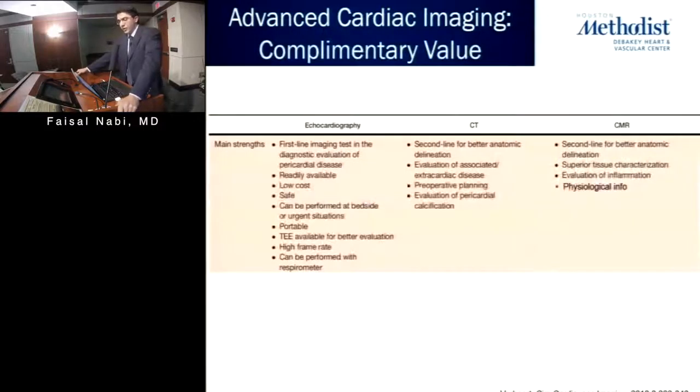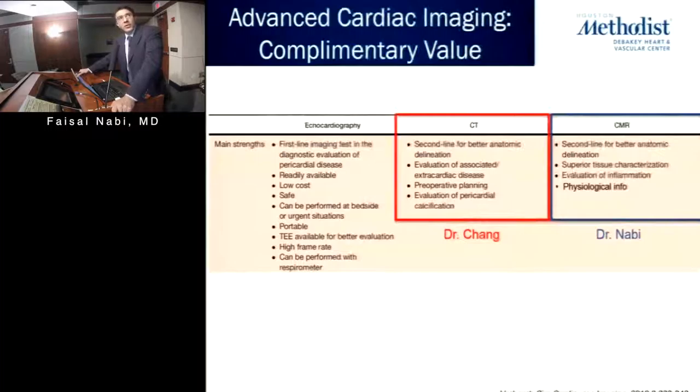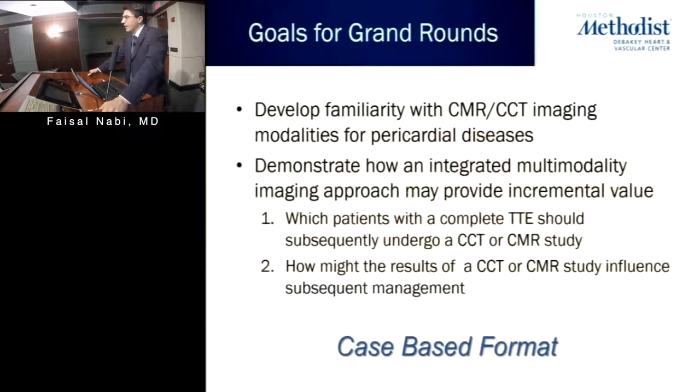So for the purposes of this talk, we will be focusing on the strengths of cardiac CT and cardiac MRI. Dr. Chang will be going over in detail the strengths of CT and also answering all your questions at the end. And my role will be to tell you all the specific strengths of cardiac MRI. I hope during the talk you will appreciate its outstanding ability to show you anatomy, give you physiological information, the superior tissue characterization that it has, and also that it is the only technique we have to assess pericardial inflammation.